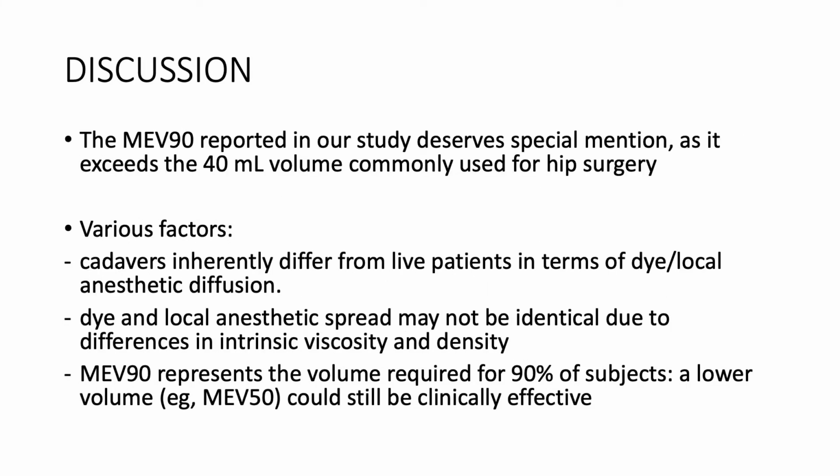Then, discussion. The minimum effective volume in 90% reported in this study deserves a special mention because they said it exceeds the 40 mils volume commonly used for hip surgery. This owes to various factors.